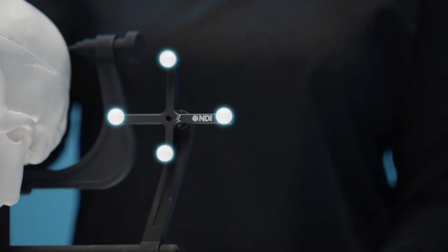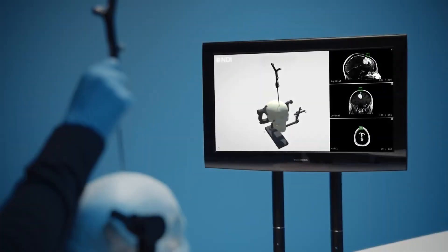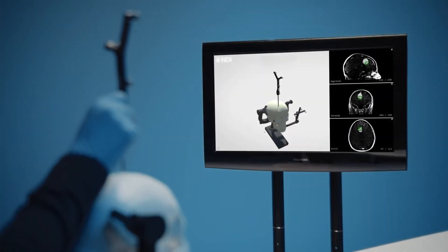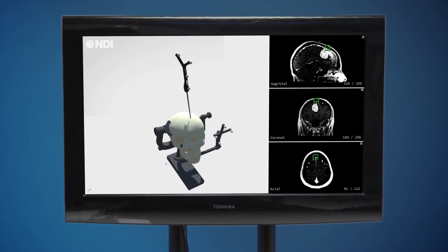A fixed reference frame represents the patient's physical position. The movement of the surgical instrument is compared to the patient reference frame and displayed relative to the patient image set, assisting the surgeon in navigating the instrument to the target treatment site.